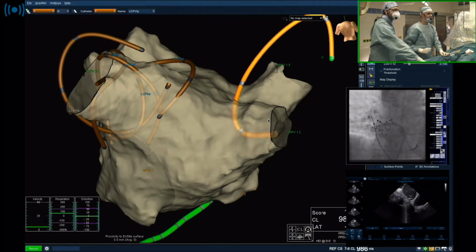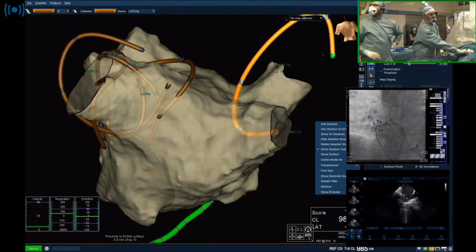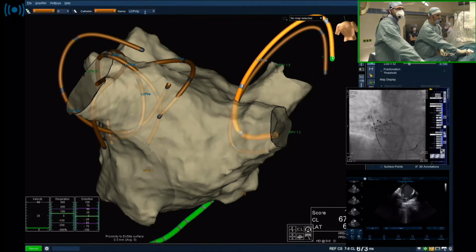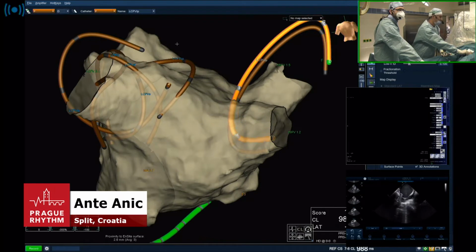Actually I like it. Show me, please. Guys, do you see that we are hugging it? Very nice. So let's start. Right inferior PV. We're going to stay in flower for the first application. Right inferior PV, pulse 1. Let's see what happens. Go.